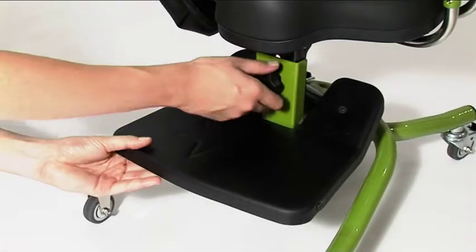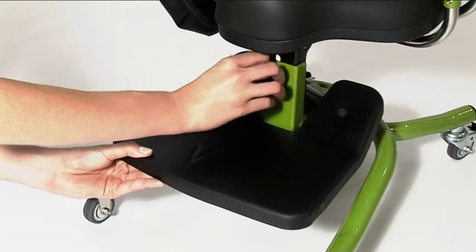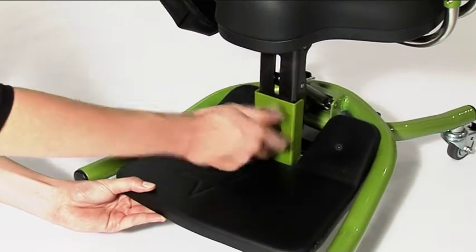To adjust the height of the footrest, loosen the handwheel. Slide the footrest to the desired position and then re-tighten the handwheel.